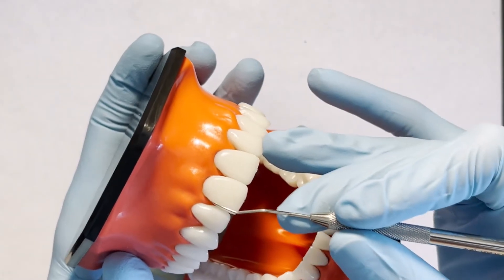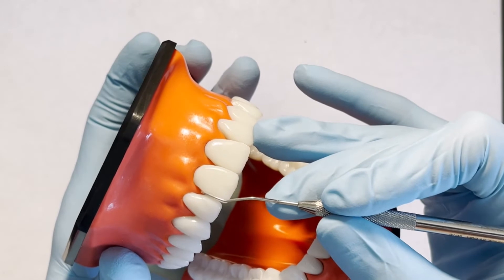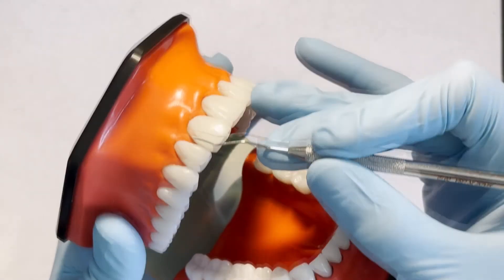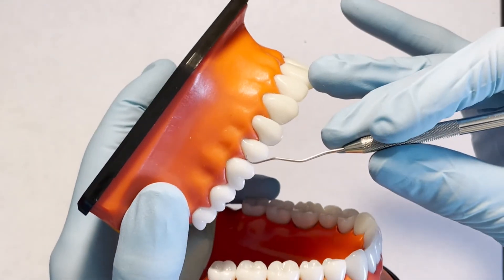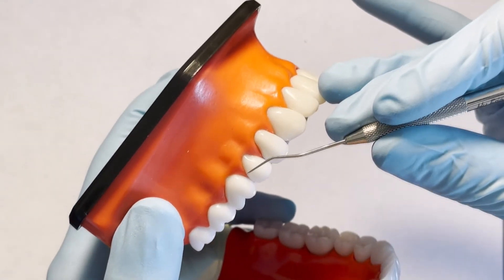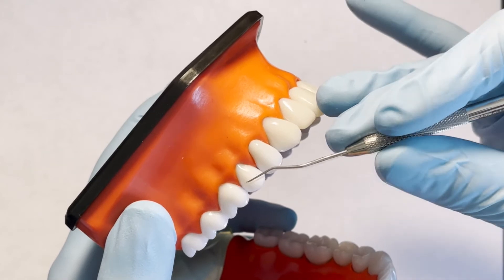Here is an example of using the incorrect working end for both anterior and posterior teeth. See how the working end does not stay adapted to the tooth surfaces, making for inaccurate exploring and discomfort for the patient as the tip may press into the gingiva.